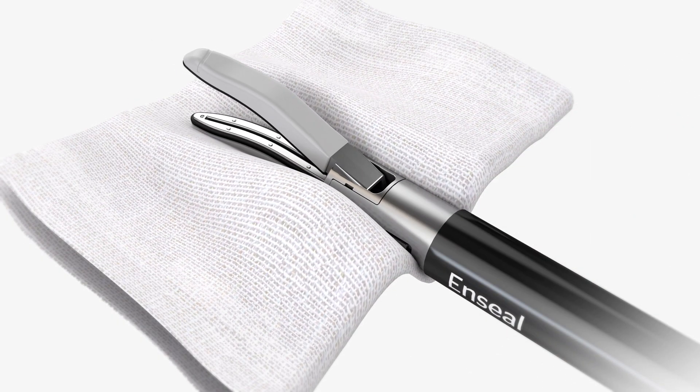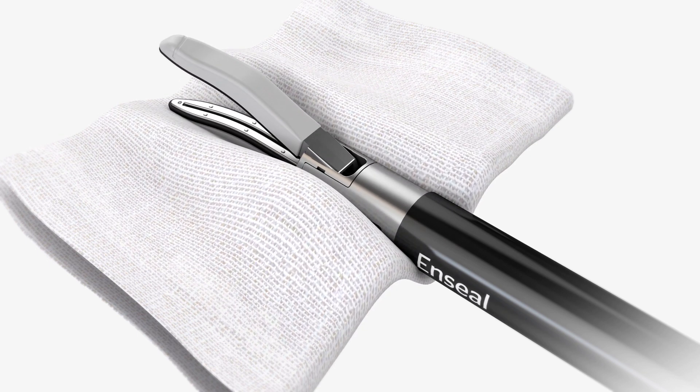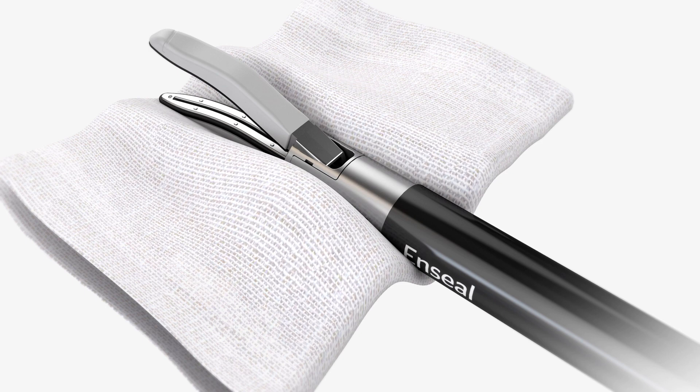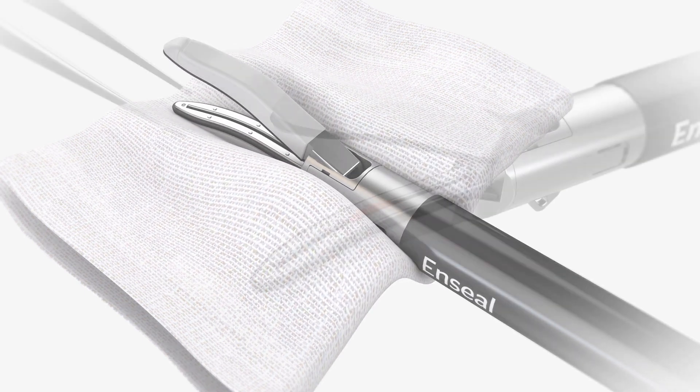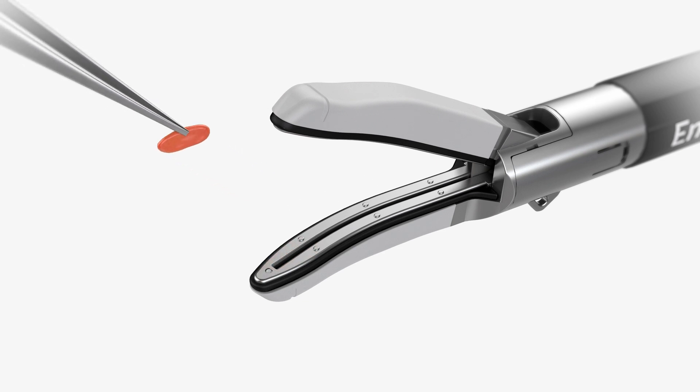Cleaning: For optimal performance and to avoid tissue sticking, clean the instrument jaws and distal end of the shaft with a sterile, moist gauze sponge throughout the procedure. If tissue is still visible in the clamp arm, use forceps to remove residue, taking care not to actuate the instrument.